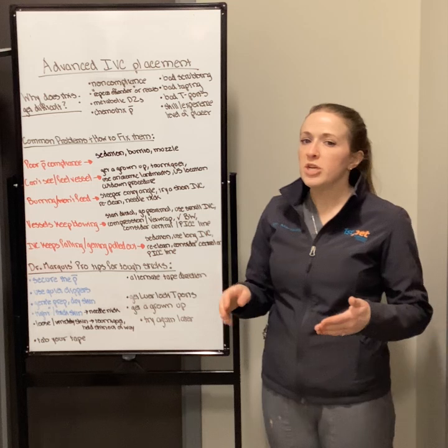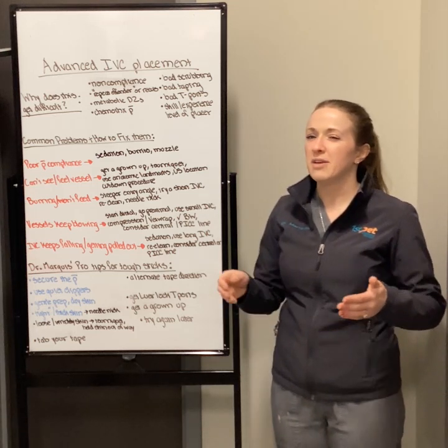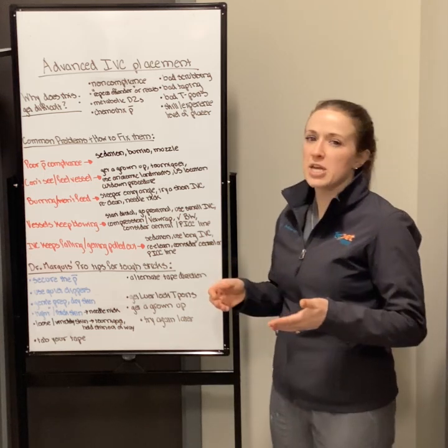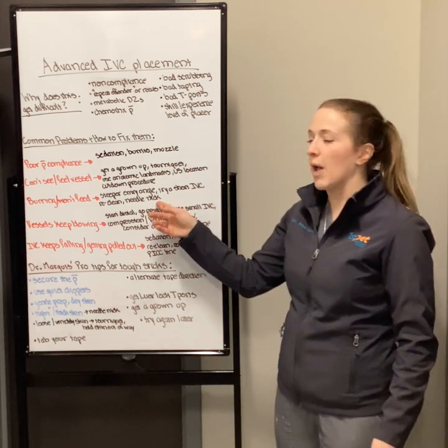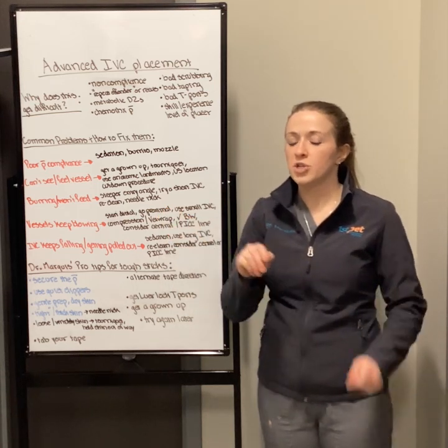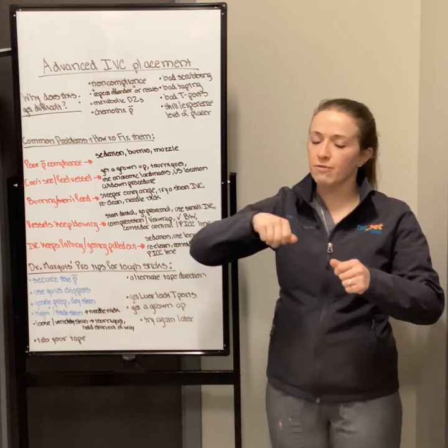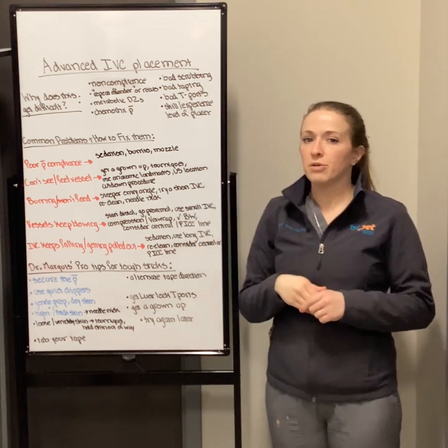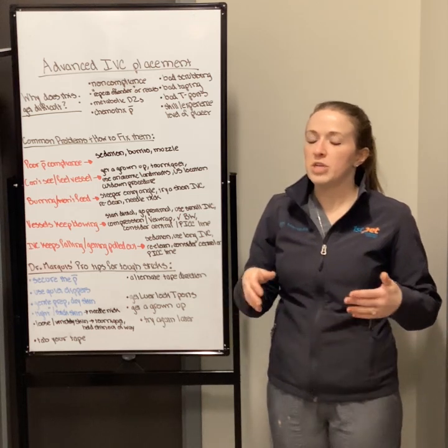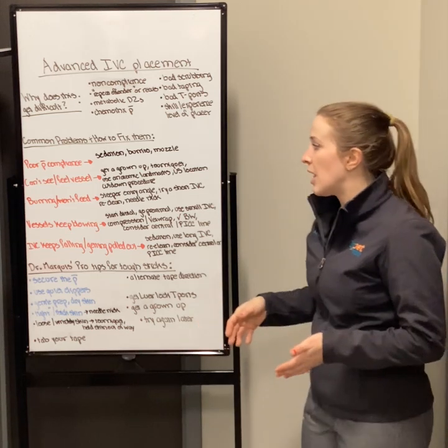In those situations, you can re-clean the leg the best you can, but if you have an animal with very thick, oily, tenacious skin that keeps burring catheters, I would needle nick them. Take a 20 gauge or an 18 gauge needle and don't saw through the skin, but just feel where you would want to put your catheter in for a puncture, and make a tiny little nick. By getting through the skin with your needle, you're going to decrease the work that you need to do with your catheter, and it's much less likely to shear.